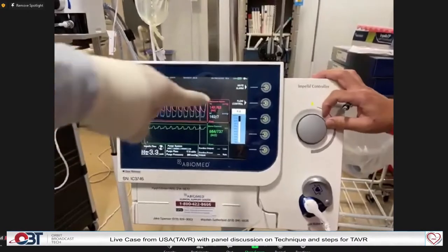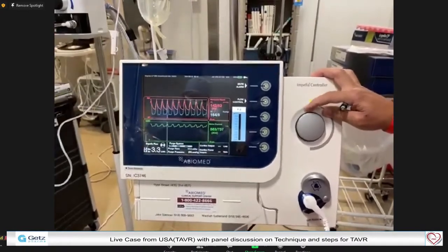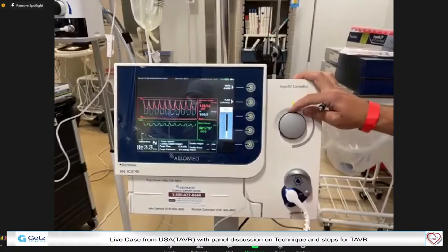Would you go to P2 and show them how that works? So this is auto at P9, but there are different levels from P9 to P2, P3, and it depends on how much suction and how much cardiac output we want. And then we've got it at auto right now. You saw the single axis earlier that we showed you?